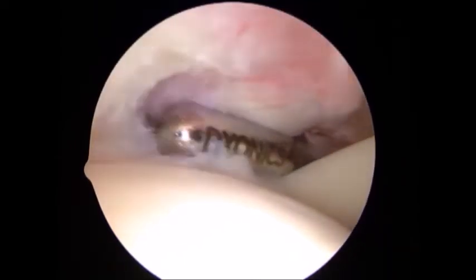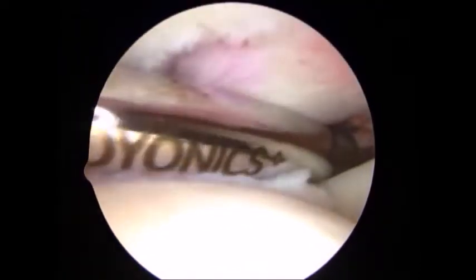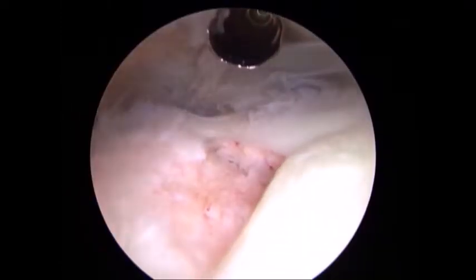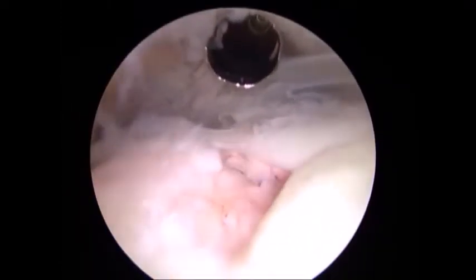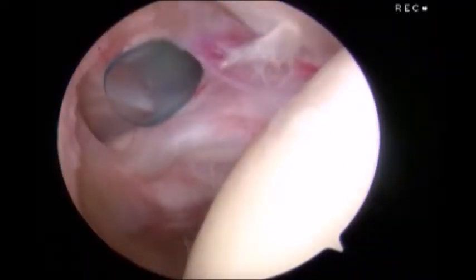In fact, we can note that the rotator cuff tendon tear is full thickness in nature, and the fluid extravasation likely comes from fluid within the subacromial space moving back and forth into the glenohumeral joint. And in this shoulder in the subacromial space, again, we can see the full thickness nature of the rotator cuff.